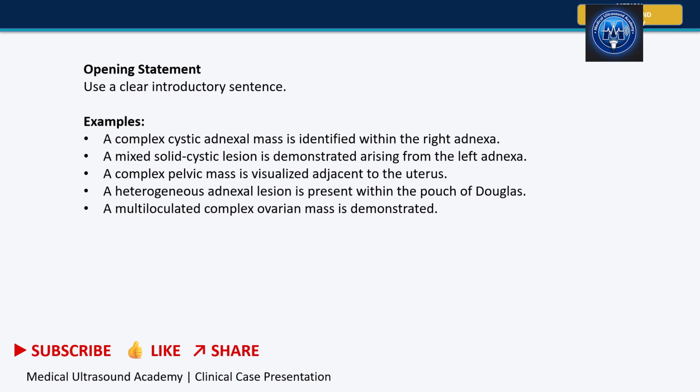A mixed solid cystic lesion is demonstrated arising from the left adnexa. A complex pelvic mass is visualized adjacent to the uterus. A heterogeneous adnexal lesion is present within the pouch of Douglas. A multiloculated complex ovarian mass is identified.